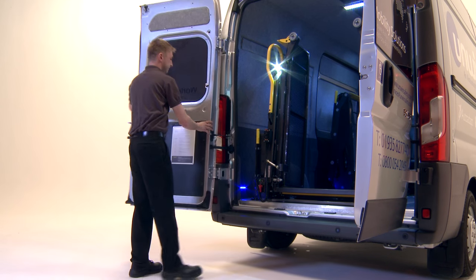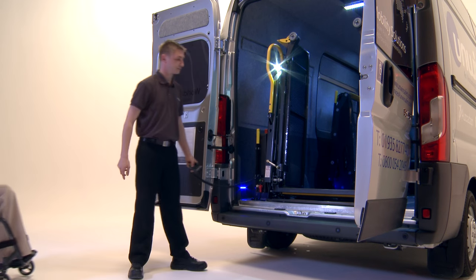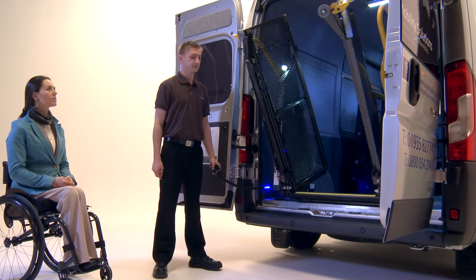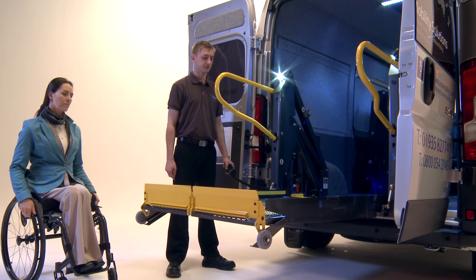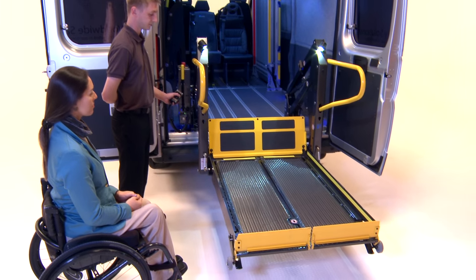Ensure the attendant and the service user are outside of the lift deployment area. Press the deploy button to unfold the lift platform until it reaches the vehicle floor level. Press the down button on the handset to lower the platform to ground level.